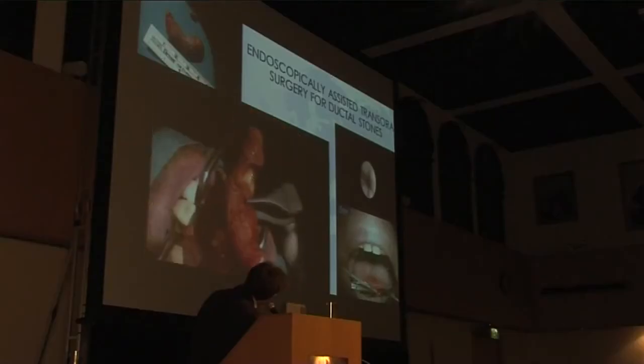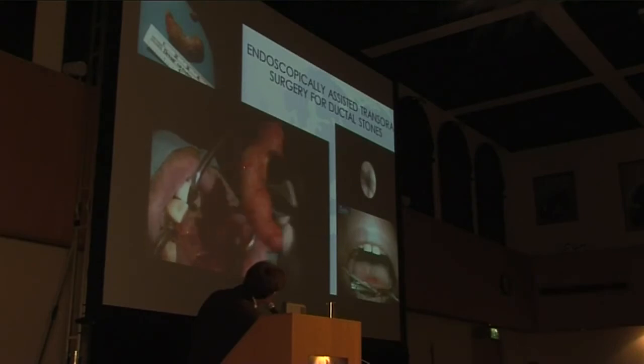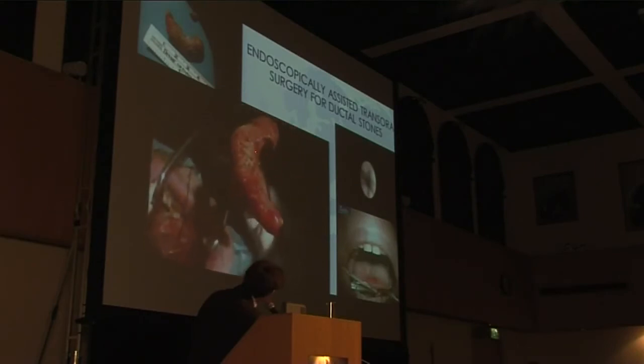Here you can see the relationship with the lingual nerve. The incision was made with a minimal incision — that is the preferred way to open the duct in the time of minimally invasive methods. The stone can be easily removed by elevators and other instruments to favor the release of the stone from the main duct. The stone, as you can see here, is a 4 cm stone that begins in the main duct but continues also into the parenchymal region.